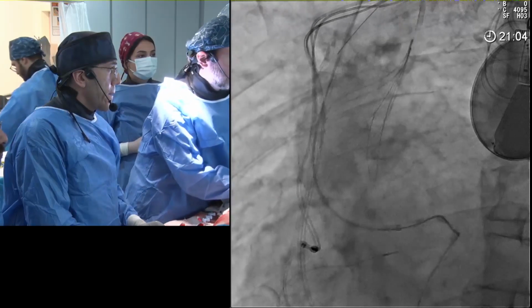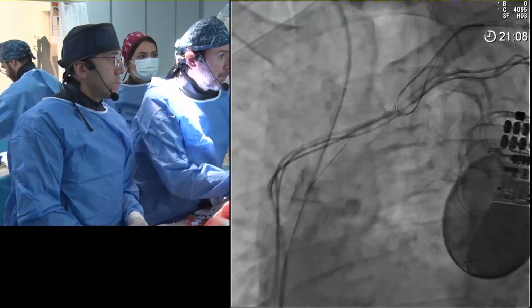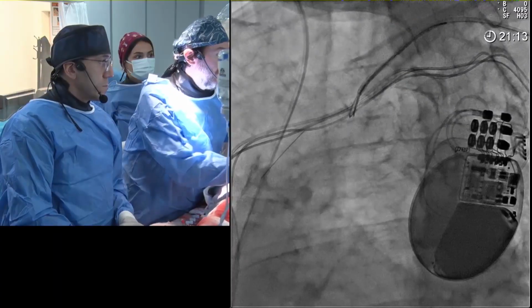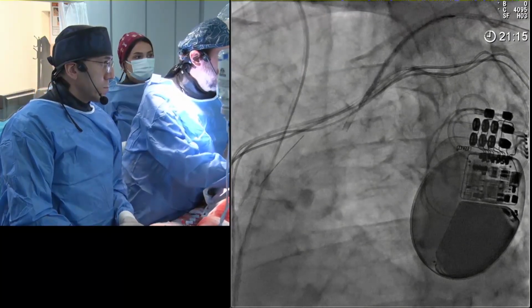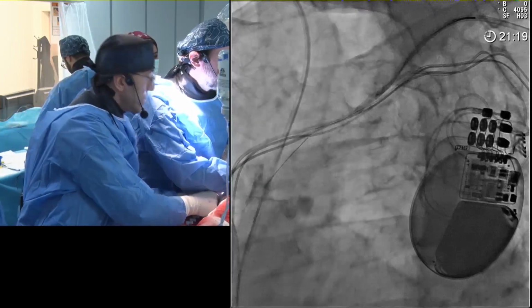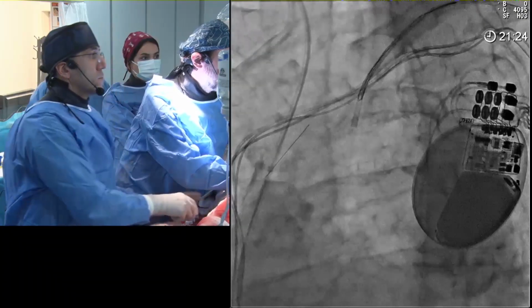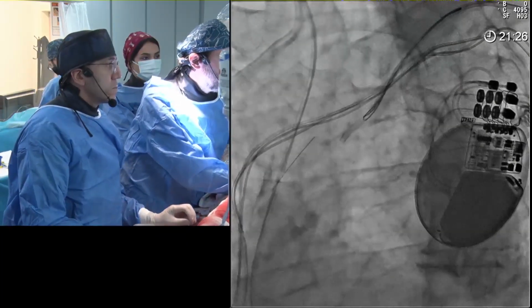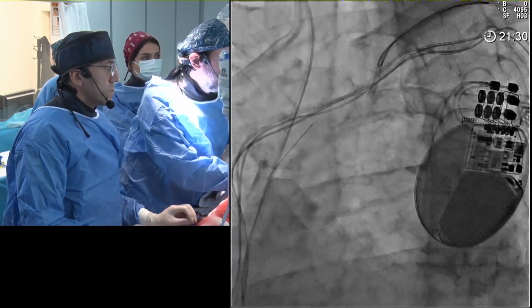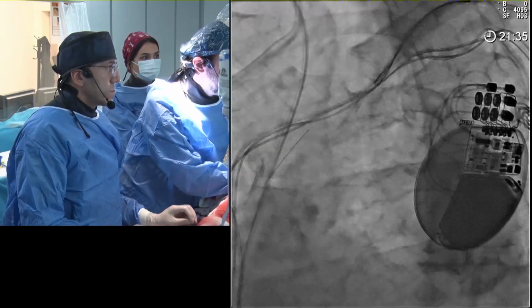Okay. Yeah, in terms of the snare, this three-loop tulip snare is most easily used. So I will point my guiding catheter towards a narrow space. So it could be the left subclavian, the truncus, and yeah. I will try to go into the truncus first. Maybe I can do it also downwards, but right, and the brachiocephalic region as well. Yeah, but the guiding catheter does not have the right shape to go into the.